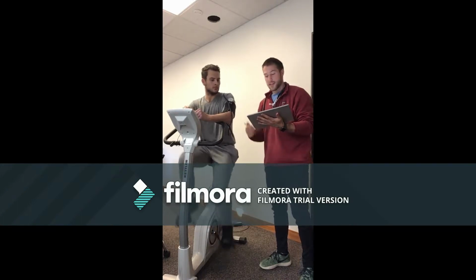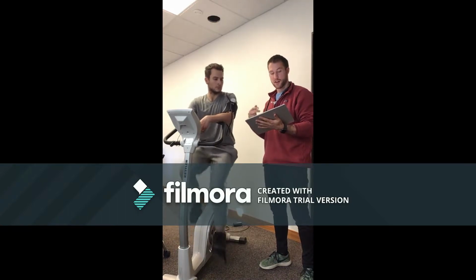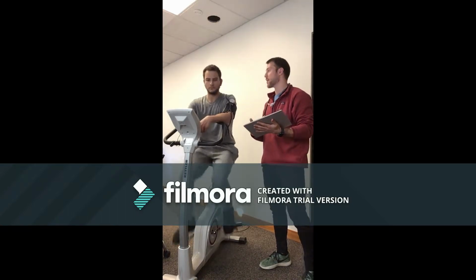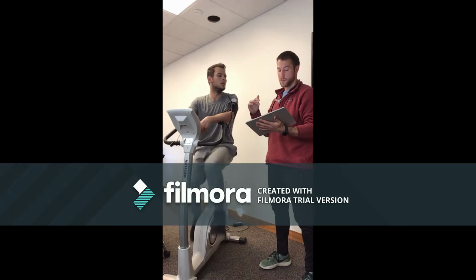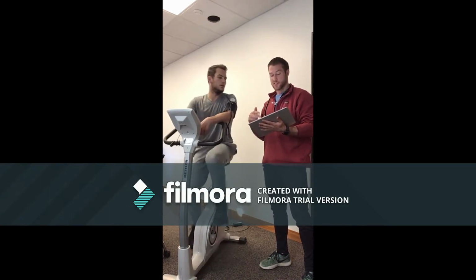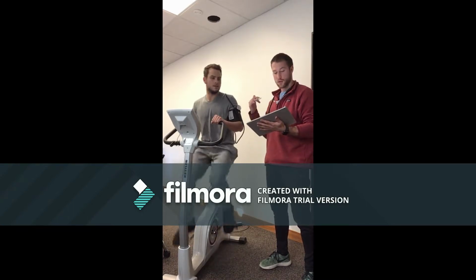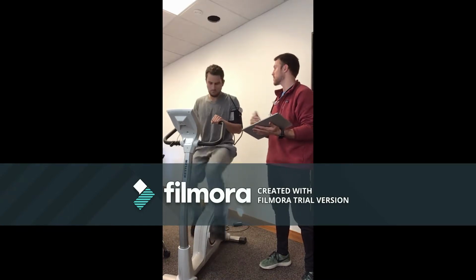When we were taking your initial resting vitals, we wouldn't have started the test if your heart rate had been above 120 beats per minute or below 50. We also wouldn't have started if your resting systolic blood pressure was above 200 or below 100, and for your diastolic blood pressure if it was greater than 110. So we didn't have that.